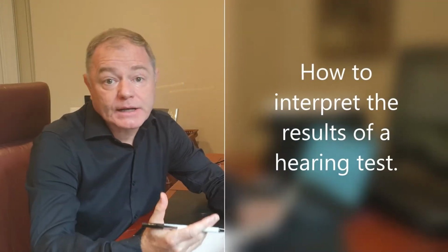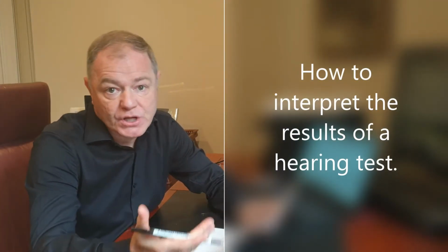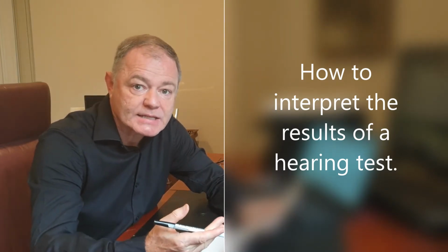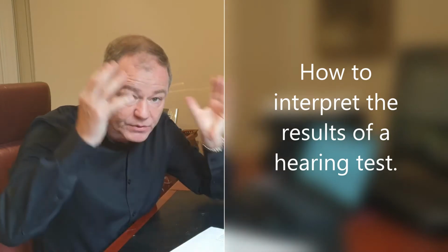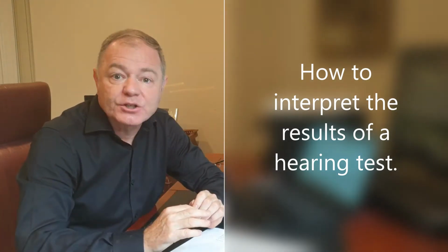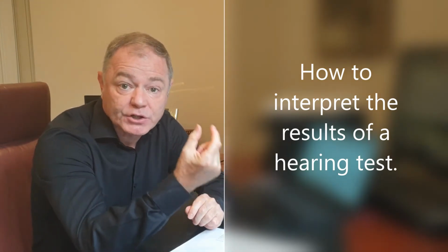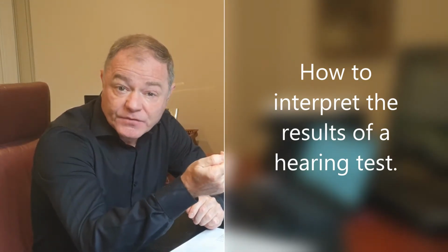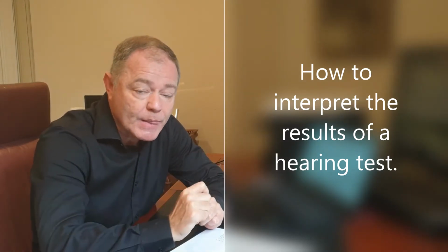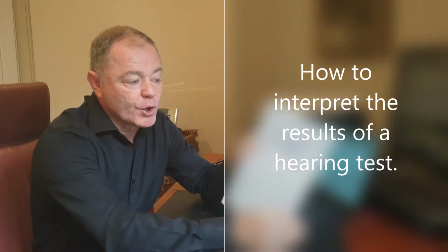In this video, what I'd like to do is to give you an understanding of how to interpret the results of a hearing test. So a hearing test is a fairly simple process. Normally you'll be fitted with a set of headphones, red on the right and blue on the left, and then you're asked to say yes or press a button whenever you hear a particular tone. If the sound is even very soft, you've still got to respond that you've heard the sound. And those results are then recorded on what we call an audiogram.